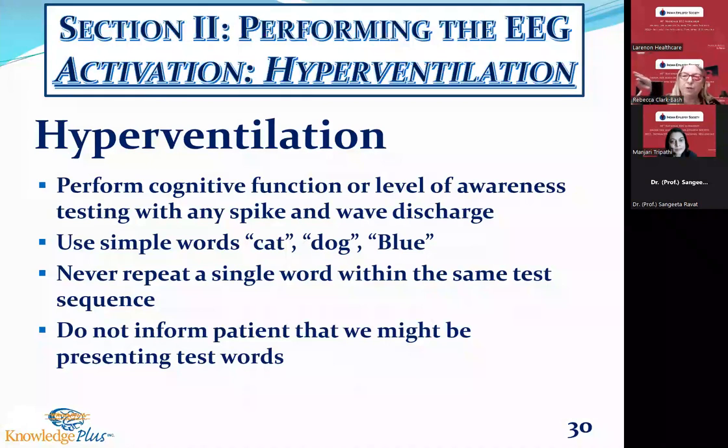When the epileptiform discharge has returned to baseline, then I say, Helen, what word did I say? And if they can remember the word, cat, you said cat, I make a note of that for neuro saying they were conscious during their episode. Or if I say, what word did I say, Helen? And Helen says, you told me to do the deep breathing exercise. She didn't hear cat, thereby validating that there was no awareness during the event.